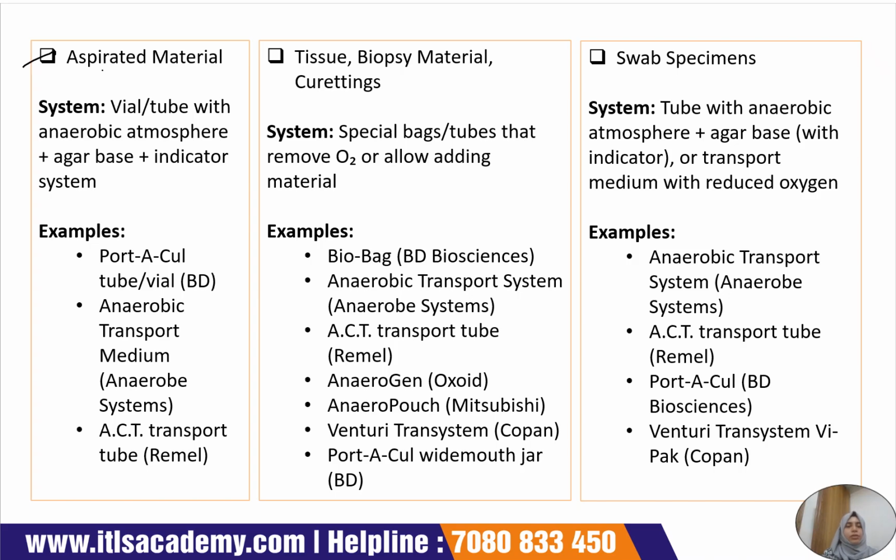For aspirated material, a vial or tube with an anaerobic atmosphere plus an agar base with an indicator system is considered. For example, the available commercial systems are the Port-A-Cul tube or vial by BD, the anaerobic transport medium by Anaerobe Systems, and the ACT transport tube by Remel.